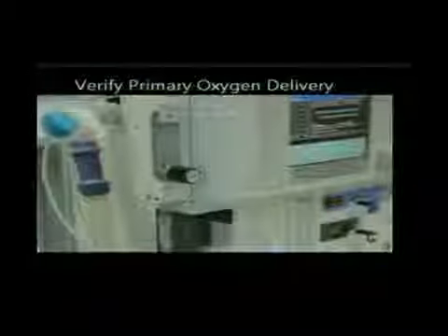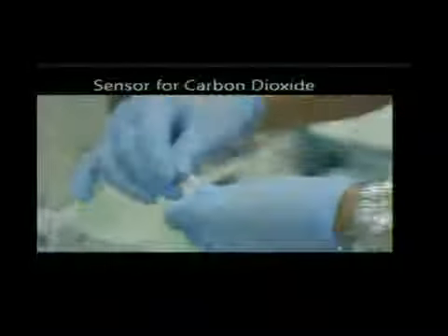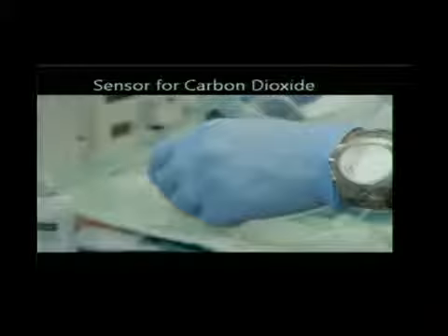So Dr. Hung here now opens it up and verifies that, yes, here's the tubing. Is oxygen coming out of this? That goes in the nose. And what he will do then is he will now stop. Oh, stop, please. Sorry. So he's looked at the tubing. There were two little, what we call a cannula there, one for each nostril. Only one contains oxygen. The other tubing is used to measure the carbon dioxide.